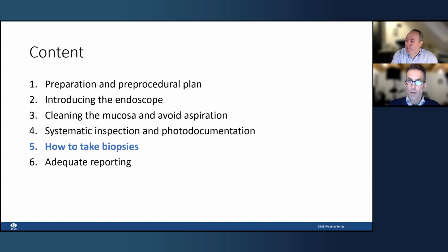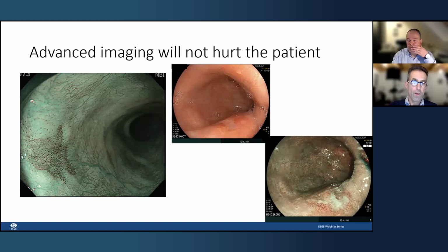Raf, yeah. And I have a couple of short questions from the audience. The first question, or maybe remark or question, is: should you take photos when you go in or when you go out after cleaning everything? The argument for making pictures when you go in is that you might traumatize the mucosa with your endoscope and then create artificial lesions. At least Gerard Isenberg mentions this. What's your opinion?